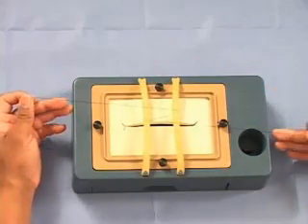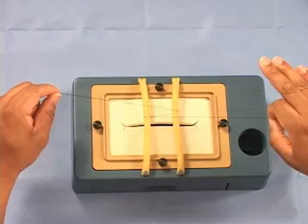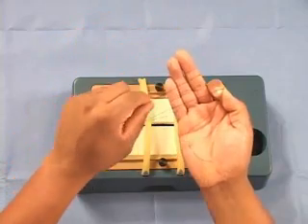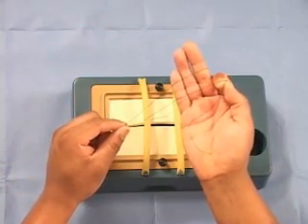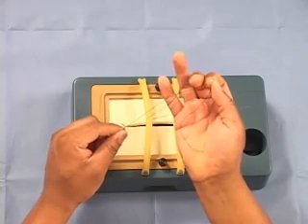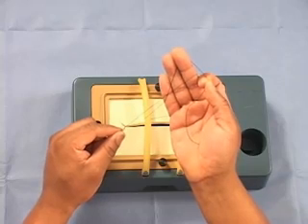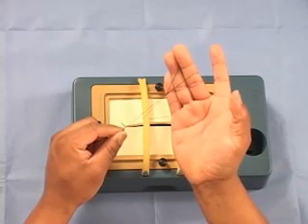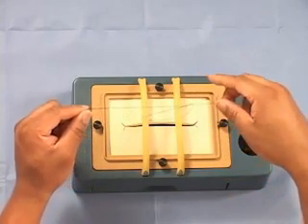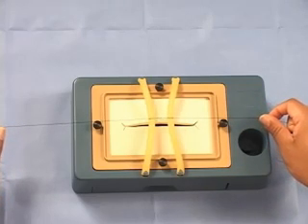Now, let's practice tying this knot. Start off with the near strand in your tying hand, palm down. Now, rotate palm up. Let the far strand go over the top of your tying hand. Now, bend the middle finger and trap the near strand in between your middle finger and ring finger. Now, let go with your index finger and thumb. If you rotate your hand palm down and come through the loop, you have just completed your first throw. Notice that this knot will go down flat.